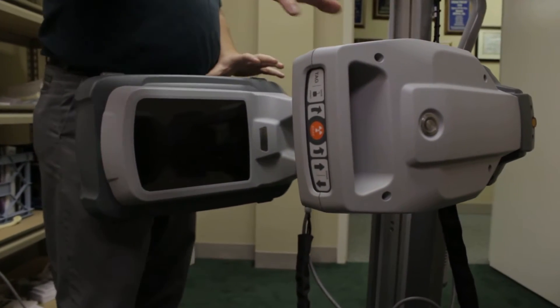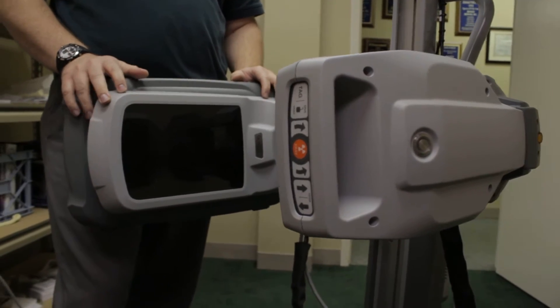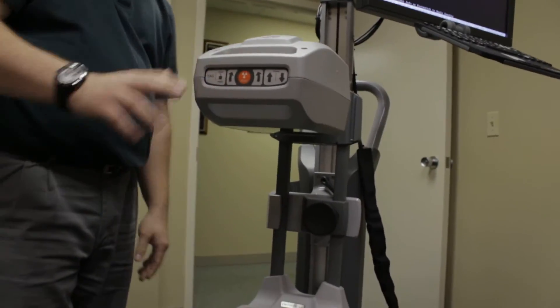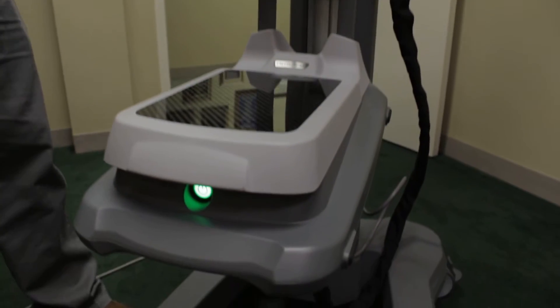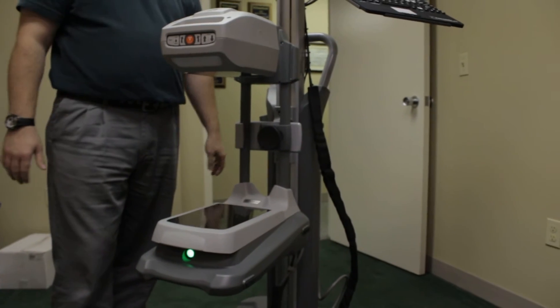You can take this unit just by itself, put it in an office, set it on an office desk, bring it out into a locker room. It's perfect for a sporting team where you need to get an x-ray of an extremity or a bone and just really get that image right away.